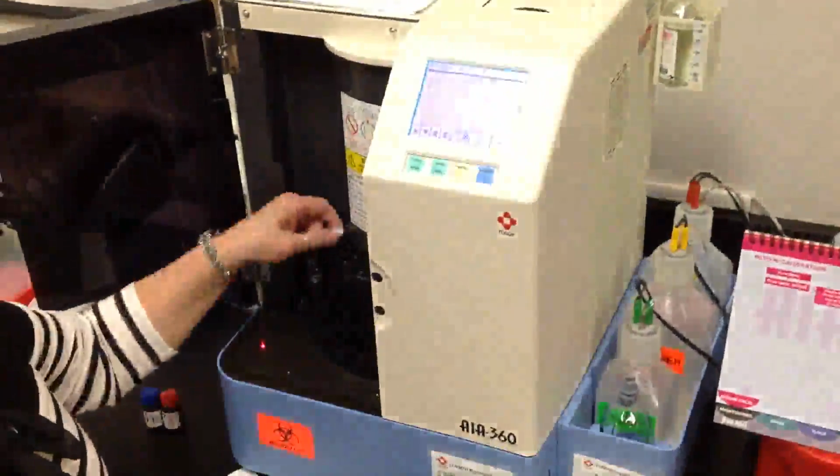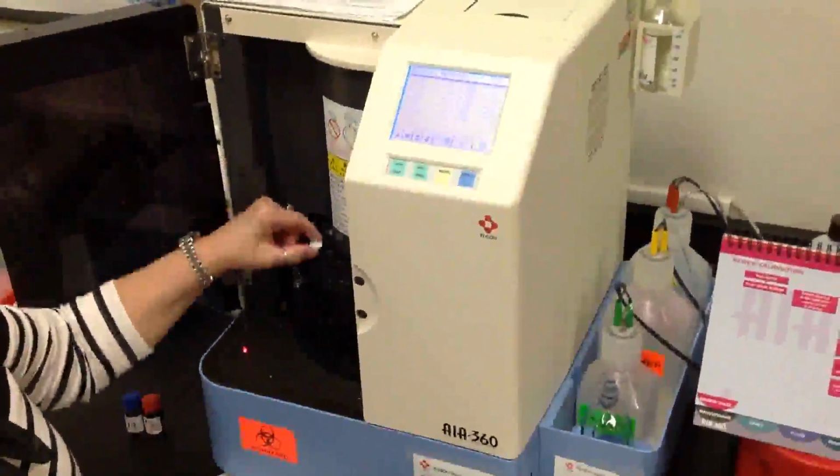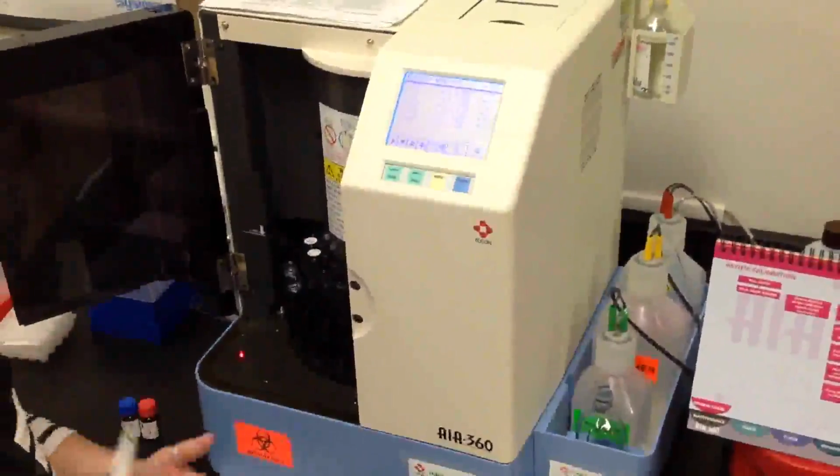You do not have to tell what your test is because it reads the test code and lot number on the sample cups. Once these come off, we will go to our QC section of our log and set up a QC tally sheet with the specific ranges given in the package insert for this control material. And we will make an indication that it was a new calibration. And the calibration for this curve then will be acceptable, ready for use. Okay.